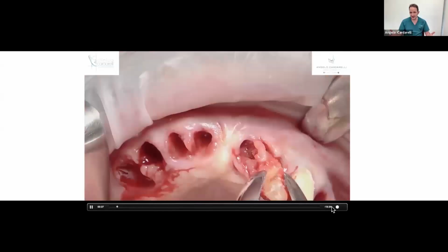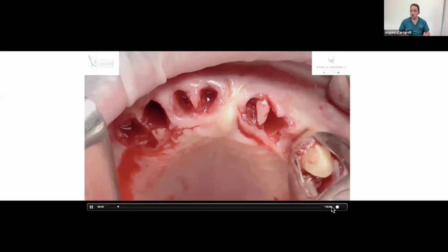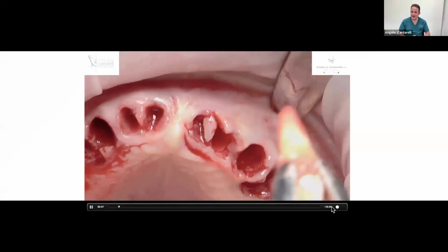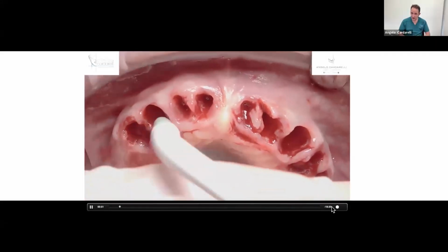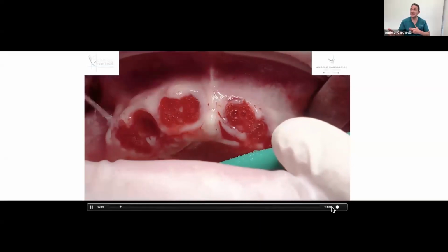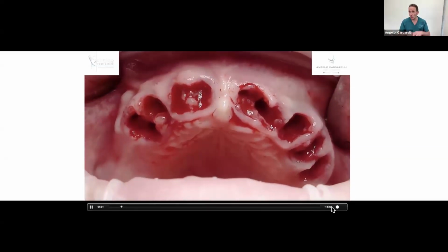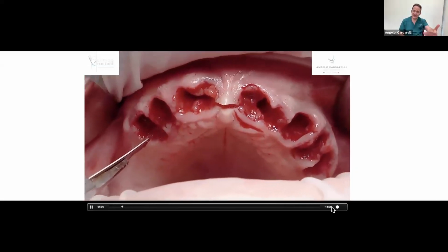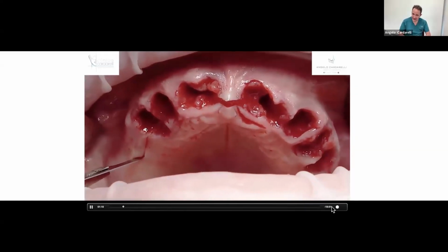Using 2 tilted implants in the posterior and 2 straight in the anterior, using 2 multi-unit abutments 30 degree in the posterior and 2 multi-unit abutments 17 degree in the anterior. Then we will put the healing cap, we will make the suture, then we will take the impression with a dedicated scan body on the top of this ion. Then we can make the immediate loading. But let's see how we can manage this case.